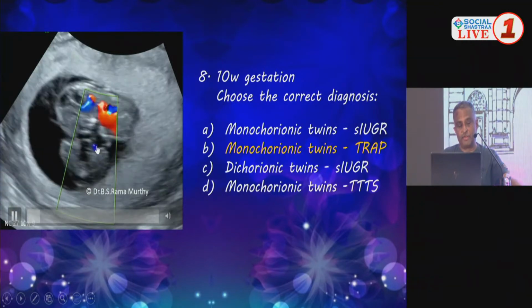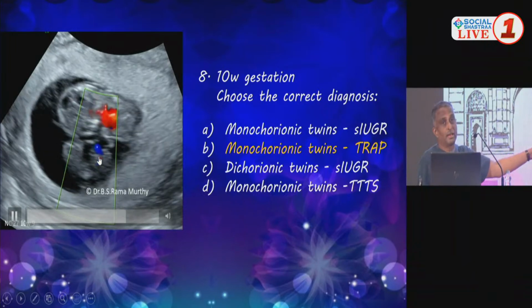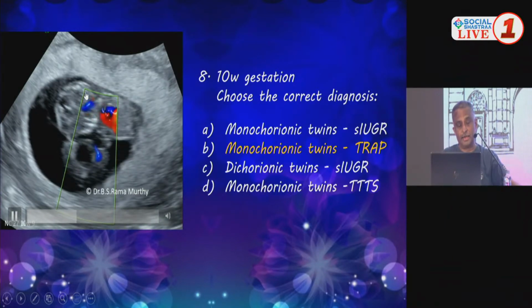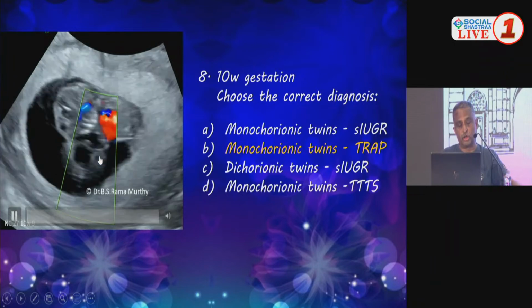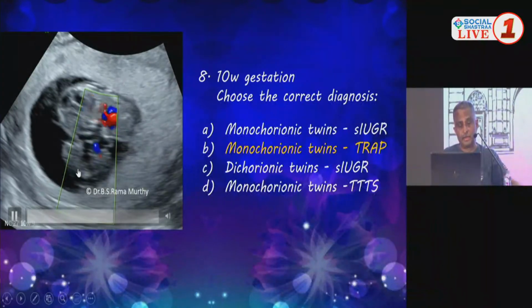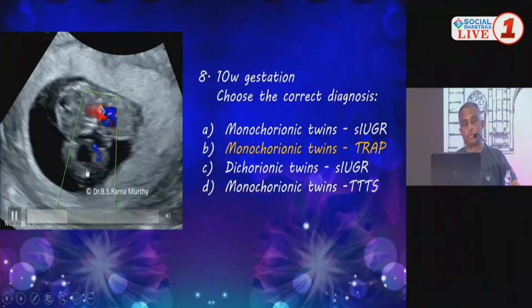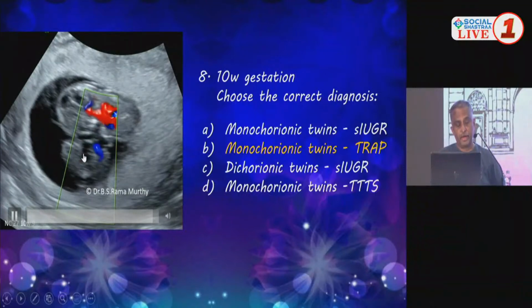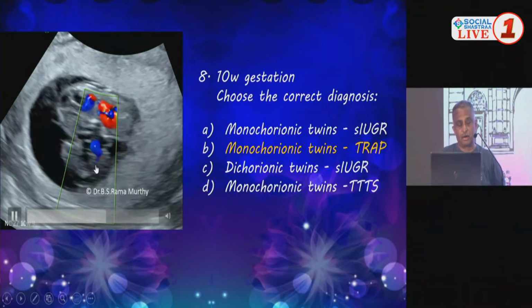Do you think it's a vein or an artery? That's the umbilical artery. Now, here the placenta is situated anteriorly, and so if this fetus were pumping on its own, what should have been the color of this? It should have been red. And also the fact that I don't see an FHR in the smaller one. In the clip that I've shown you, there is no FHR within the fetus, and this fetus is getting its blood in the wrong direction.